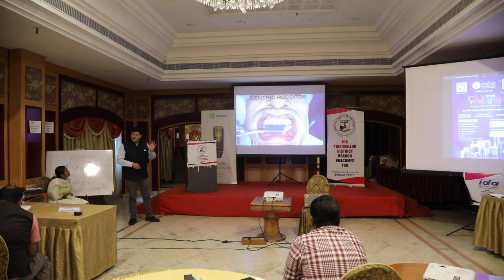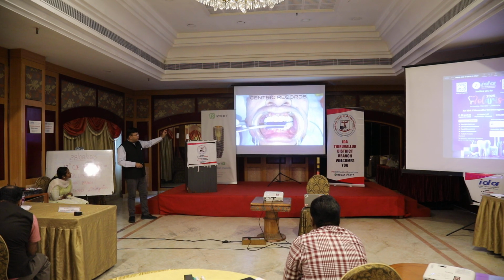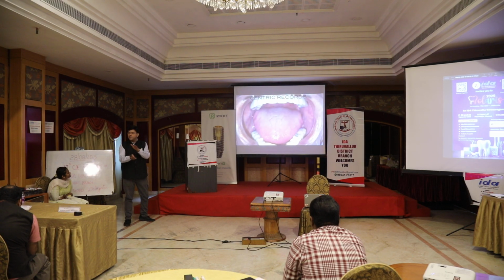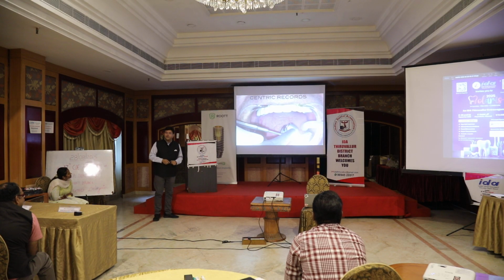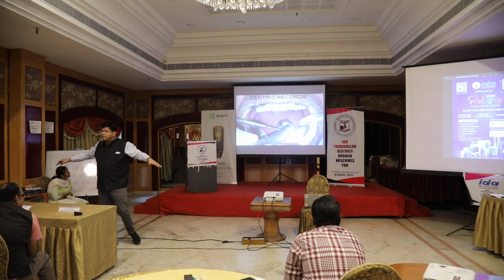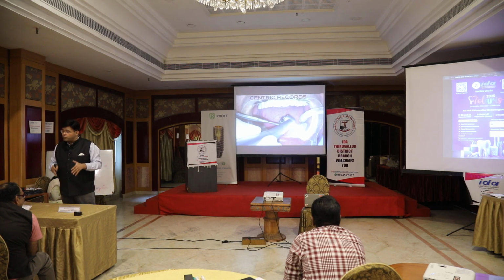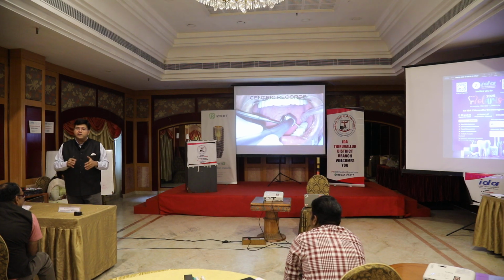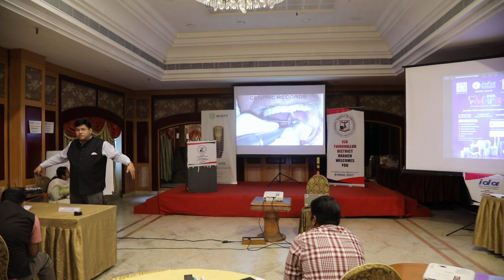Then we go ahead and I check the centric for this patient. I put a paper, I ask the patient to tap. You see how beautifully he's tapping. He has been doing it for 2 months now. So even before I put a paper, he starts doing this movement. Right? He's so well trained. But I can see that there are non-functional marks only on 3-4 teeth, which should ideally be on all the teeth. It is implant FMIR, full mouth implant restoration, which means you cannot leave anteriors out of load. Every implant is the same, whether it is posterior or anterior, all of them should have contacts, right?